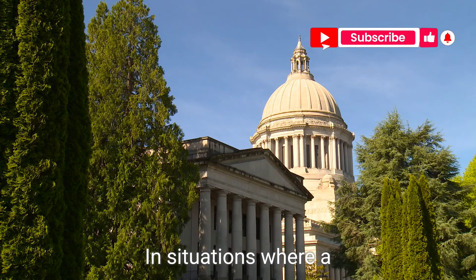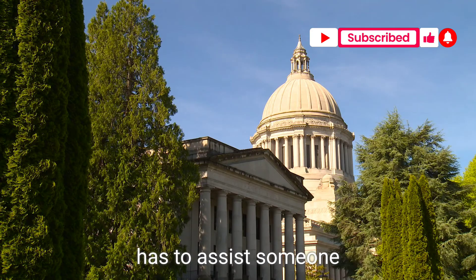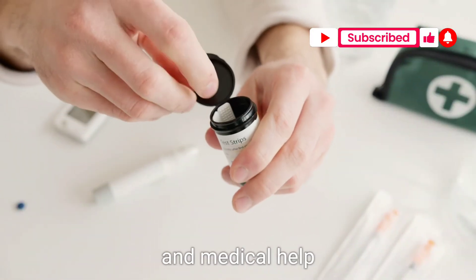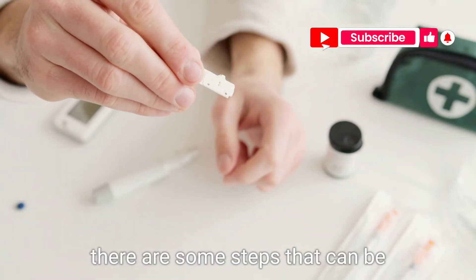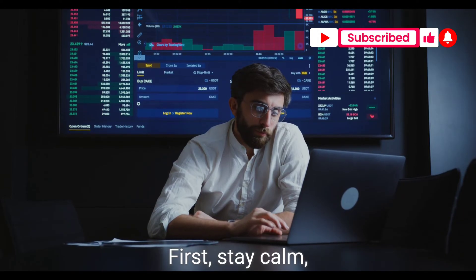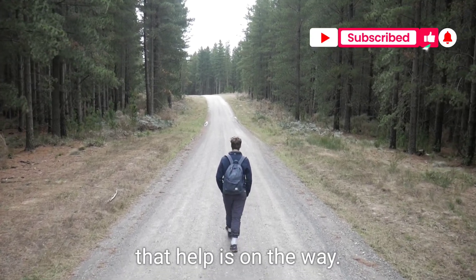In situations where a normal person has to assist someone with diabetes who needs emergency insulin and medical help is not immediately available, there are some steps that can be taken to help manage the situation. First, stay calm and reassure the person with diabetes that help is on the way.